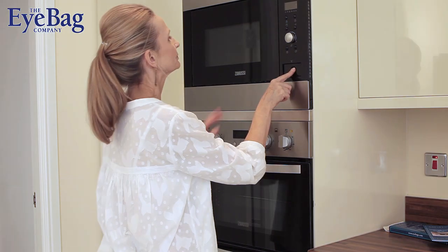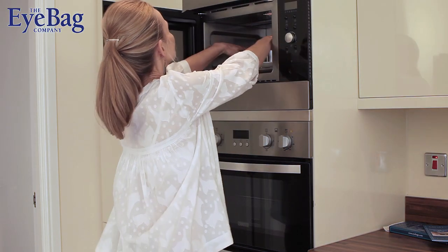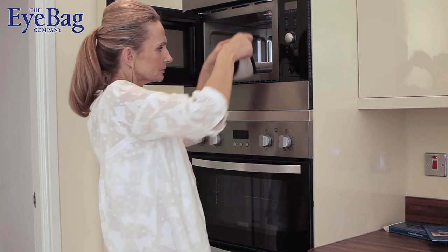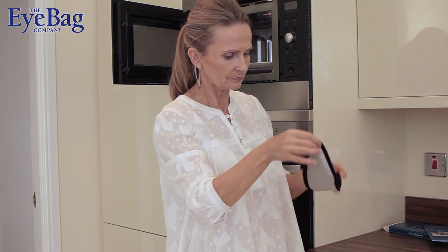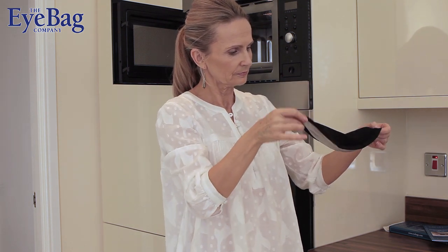Shake the eye bag to mix the flax seeds inside by holding the eye bag by its tip so that the heat is evenly distributed. You'll find that the silver side, which is made from silk, is hotter than the black side that's made from 100% brushed cotton.